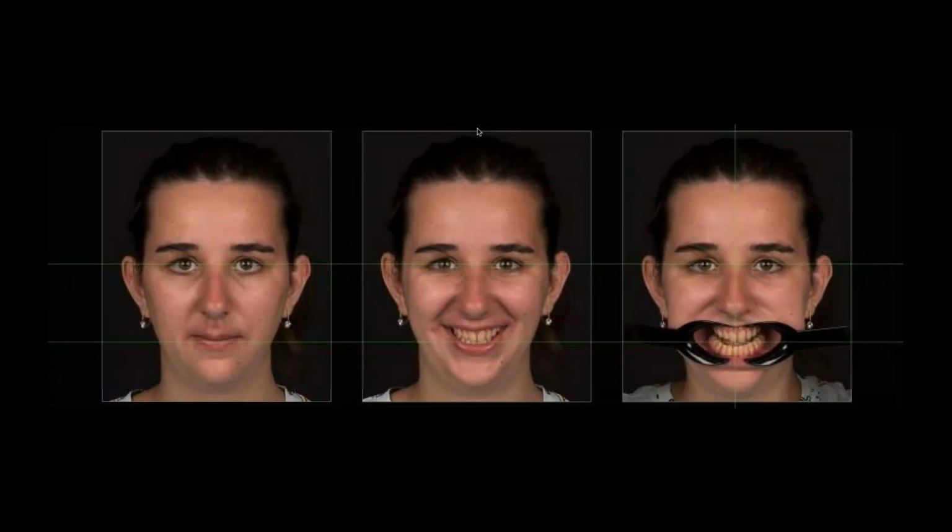So these are the pictures that I insist on from my dentist. And the most important picture is the picture of the cheek retracted, so that I can see the lines. Okay, this is the picture that is very important for me. And why is this very important?